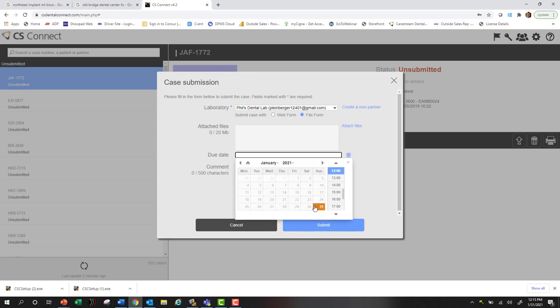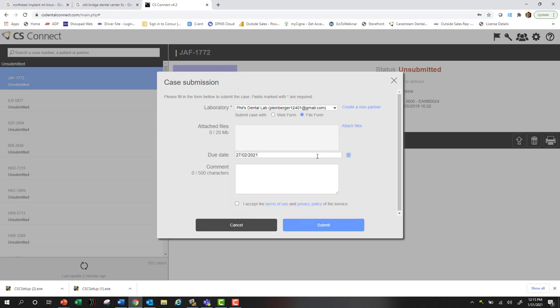You can select your due date if you need to, and any comments regarding your prescription, then select accept and hit submit.